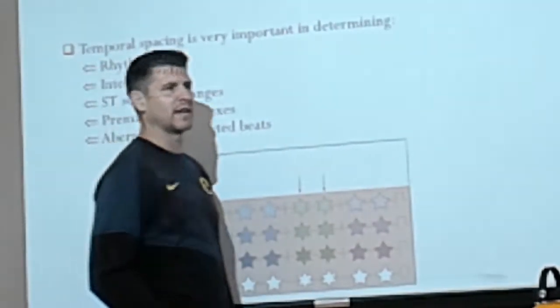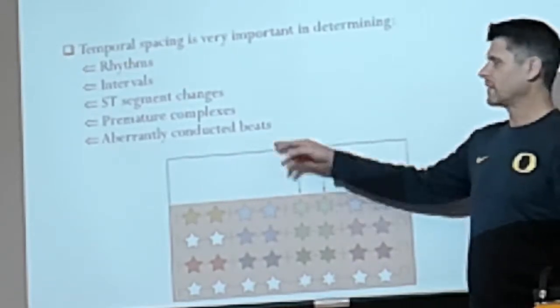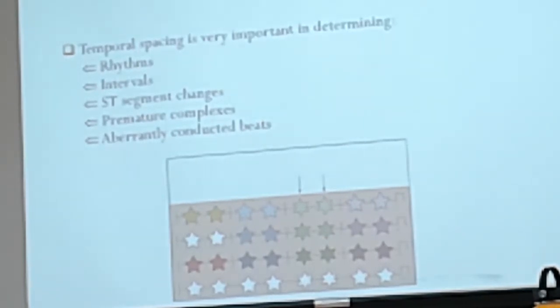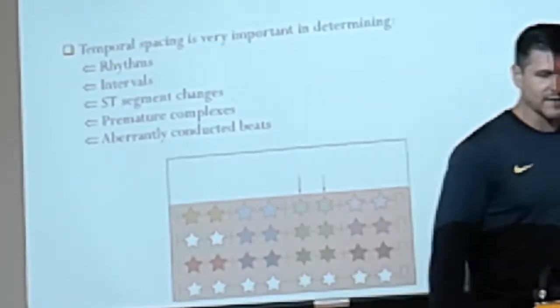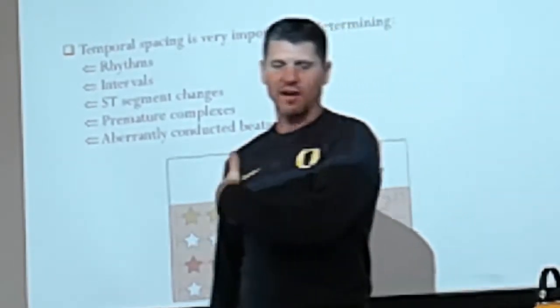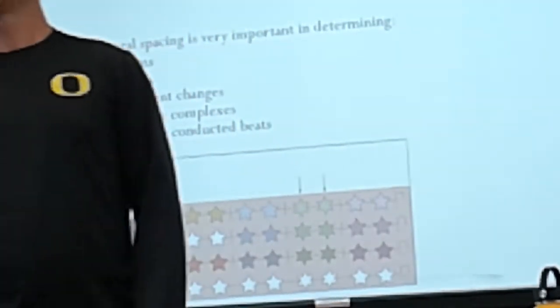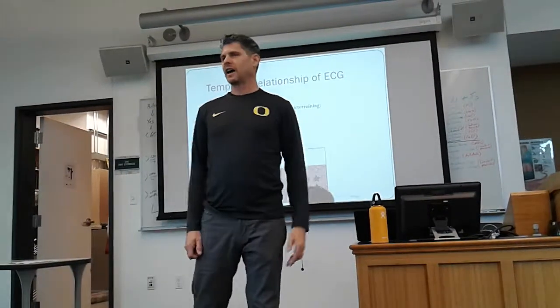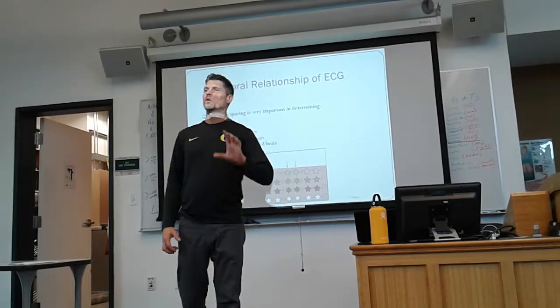It becomes very important for you to start making various measurements and be able to see things. It helps us to see premature complexes a little bit better. If we see aberrantly conducted beats, which means a beat that is taking a path of electrical activity that's different than normal, we can see that a little bit better when we look at more than just one lead. Which is why in the last class I said I want you to wipe away from your memory the way that TV shows you EKGs: this nice rounded upright P wave, this nice full Q, R, and S complex, and this nice rounded upright T wave. It's not okay to think that is normal, because it depends on the picture you're looking at, and I want you to be able to see what is normal in any of the pictures.